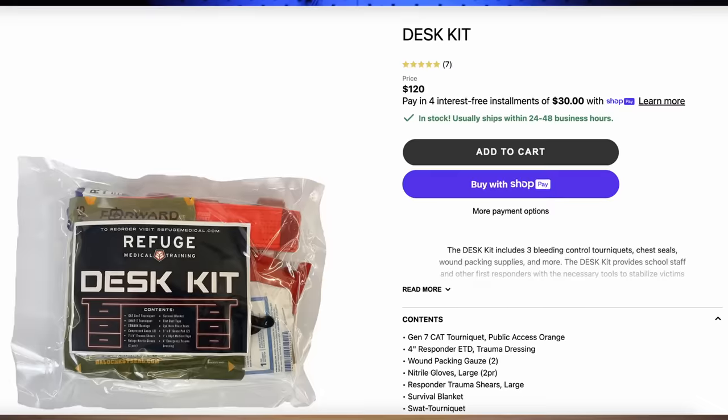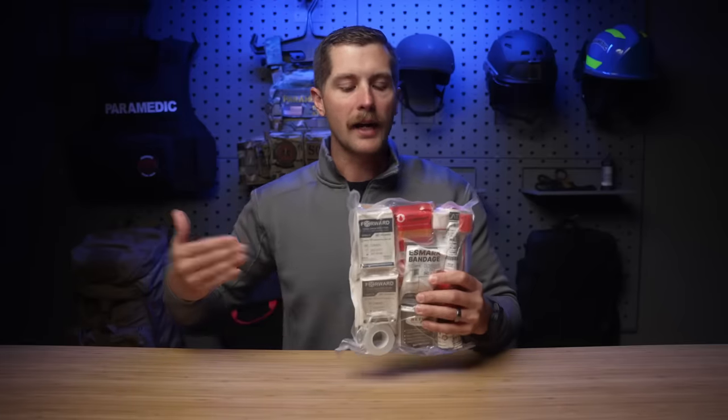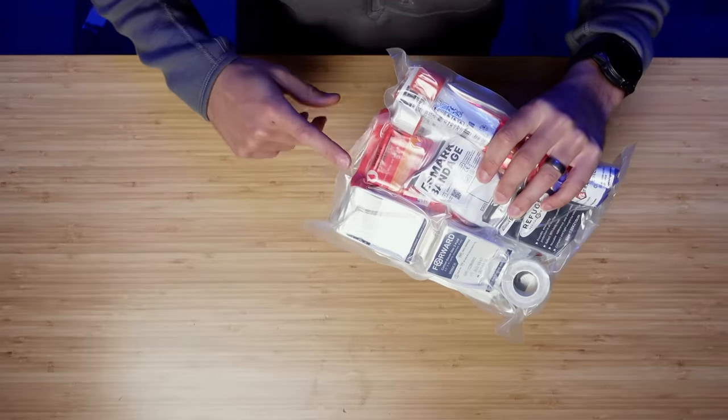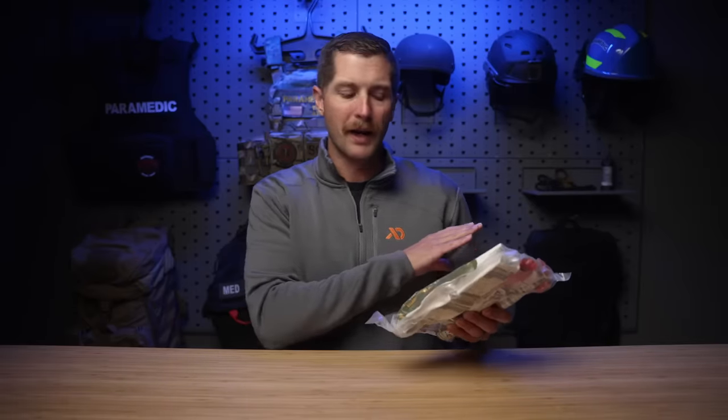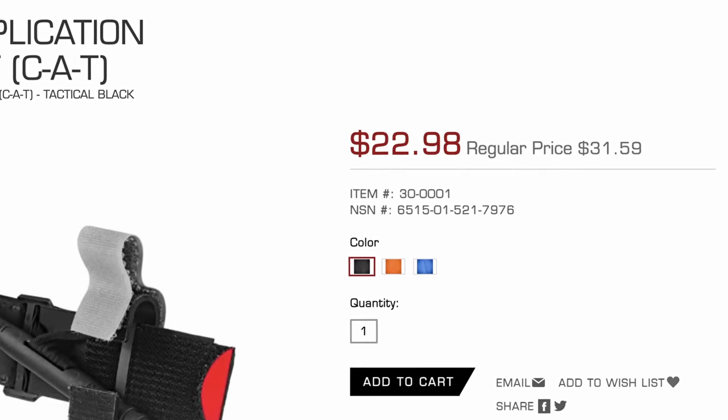Now, if you buy this kit from Refuge Medical with exactly what's in it, it'll cost you about $120. So that's about a $10 difference, and that cost I came up with for everything on its own doesn't take into account the packaging of this kit. So honestly, I think that's pretty good. That is not an extreme markup by any sense of the word. I will also say though, if you are a first responder or work in the medical field at all, you can go into North American Rescue's website and put in a code that discounts everything pretty well. But for just a normal person that just wants this for their desk at work, this is a great option.